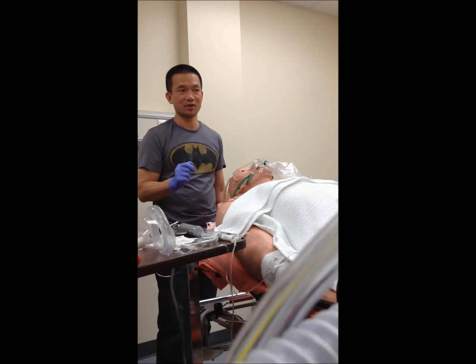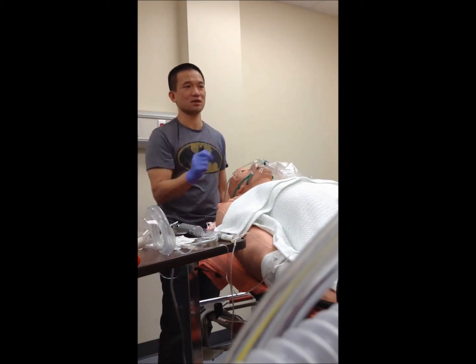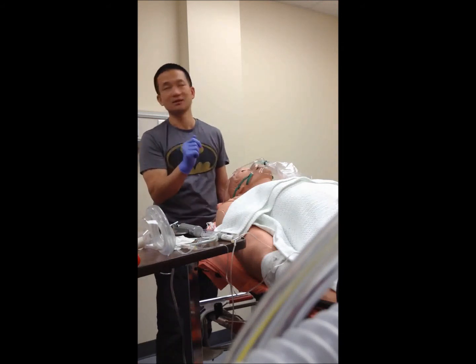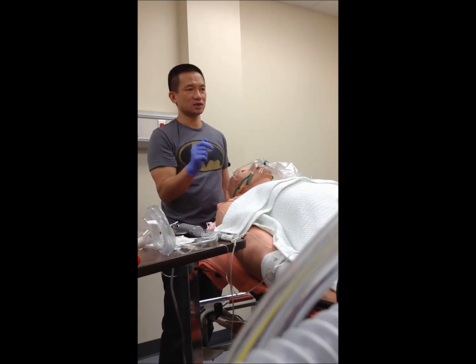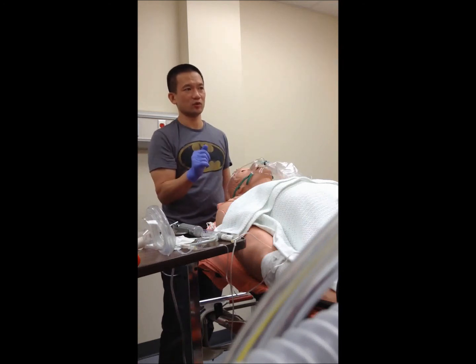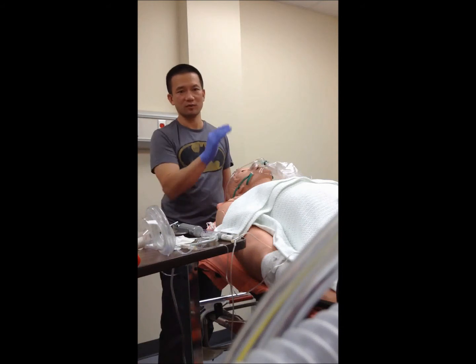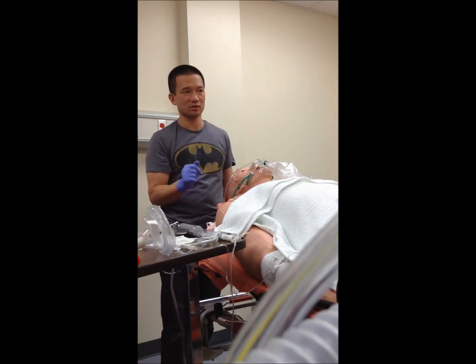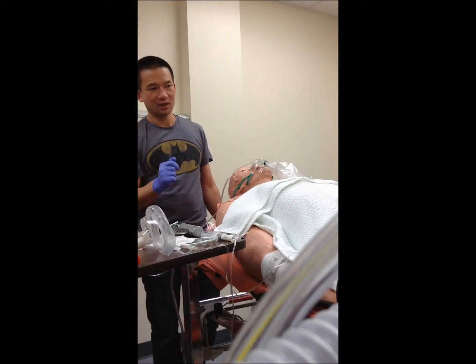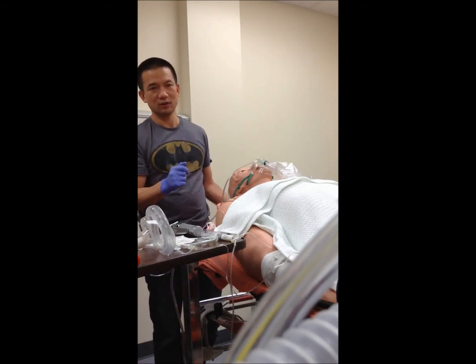R for roles — you're going to be my intubation assistant, and Louise the nurse is going to be our pulse ox watcher: watch the waveform, make sure it's good, and cycle the blood pressure every one to two minutes peri-intubation. Keep a hand on the pulse if we're worried, watch the waveform quality — because if we're dropping off that we might be losing blood pressure.